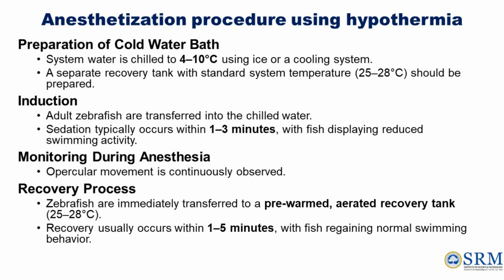Sedation typically occurs within 1 to 3 minutes with fish displaying reduced swimming activity. Monitoring during anesthesia. Opercular movement is continuously observed. Recovery process. Zebrafish are immediately transferred to a pre-warmed aerated recovery tank. Recovery usually occurs within 1 to 5 minutes with fish regaining normal swimming behavior.